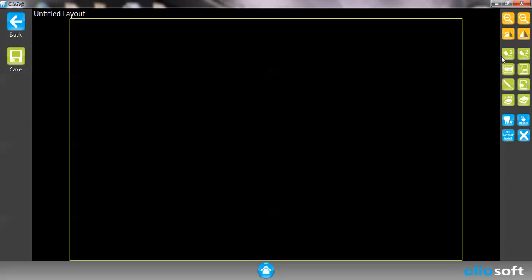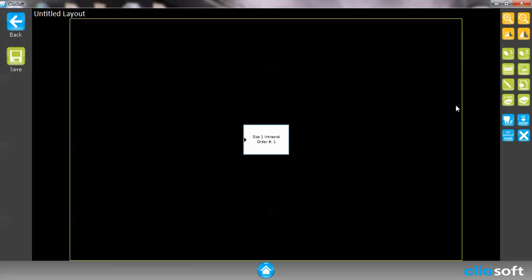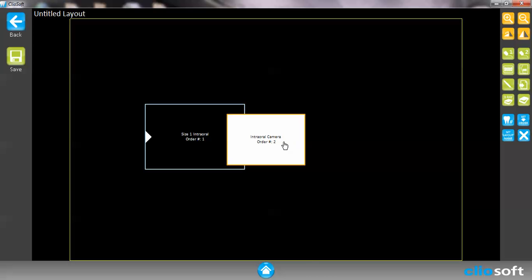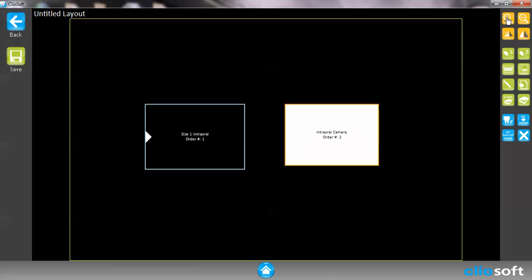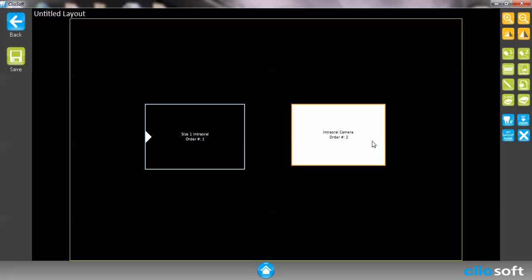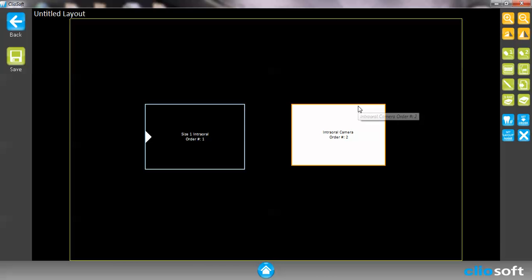We're going to continue on with our new layout. We can create different combinations. For example, I can take a size one sensor image placeholder and put it alongside an intraoral camera placeholder and therefore we can do comparison shots. I can take an intraoral camera image and then take a sensor image and show them the difference between the camera and using an x-ray.